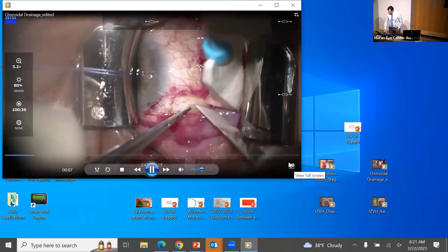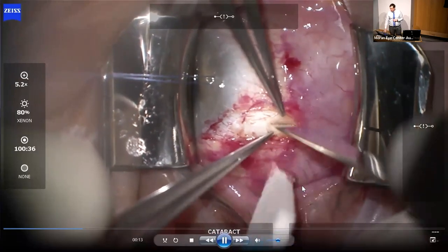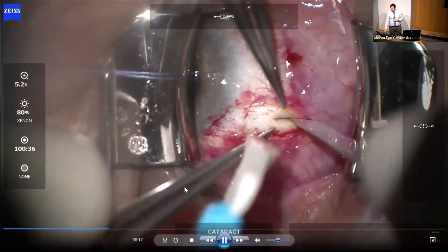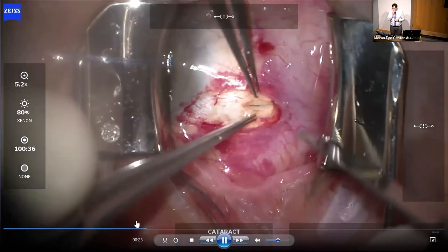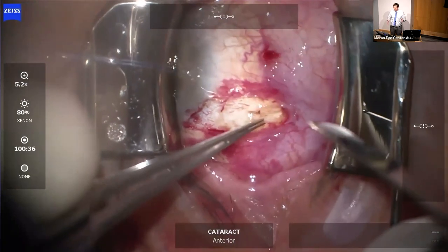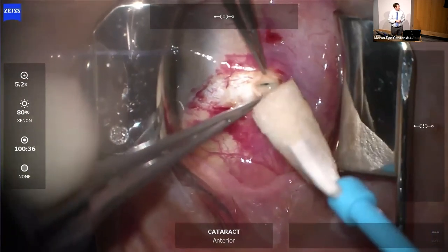But this is essentially 4 millimeters back from the limbus, a radial incision, just cutting down, and then eventually you will get a gush of fluid. You can see it right there. This is one I did during residency, and this patient had severe choroidals, and it just drains and drains. We did not need to put in an AC maintainer for the case with Dr. Stagg because the eye was rock hard.